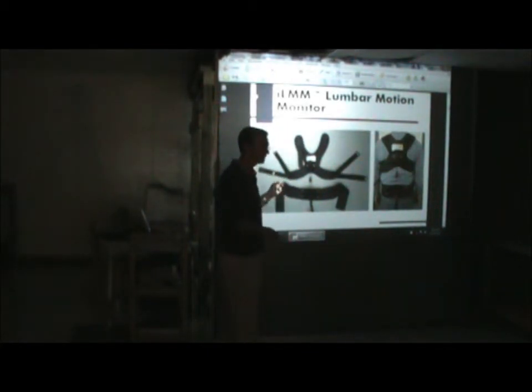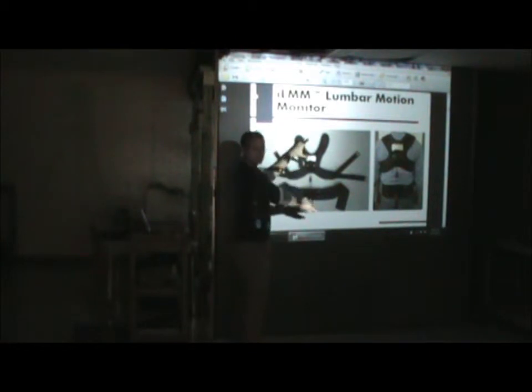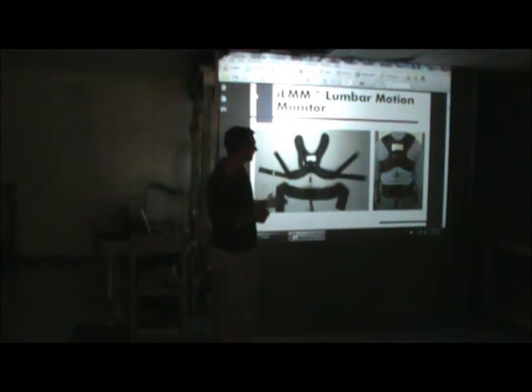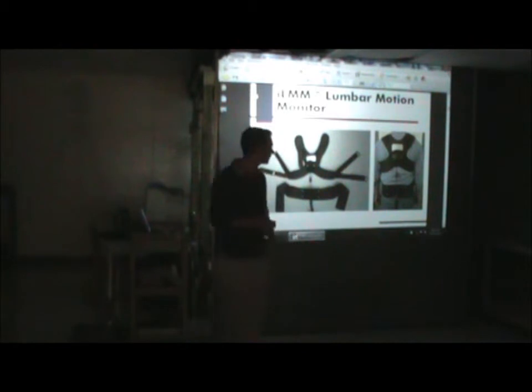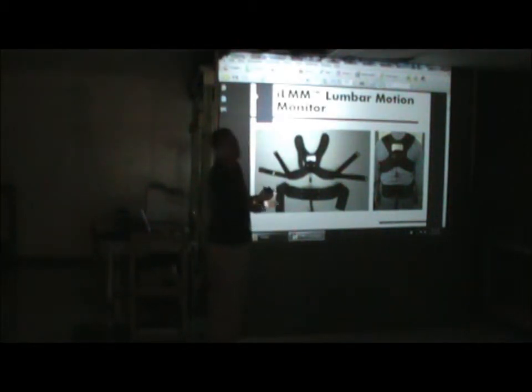For those of you who have seen the old one, and maybe we'll break it out during the workshop, you'll see this is much more compact, portable, and it's not a huge exoskeleton of the spine like the old one is. And this is actually wireless. It's telemetry. The old one, for any worker that you're analyzing, you had a long cord connecting to them, and you had to keep up with the cord. Now you can do that with the new one, but you have the option of using telemetry, wireless.